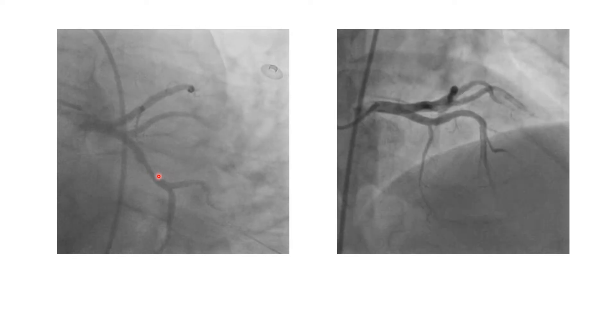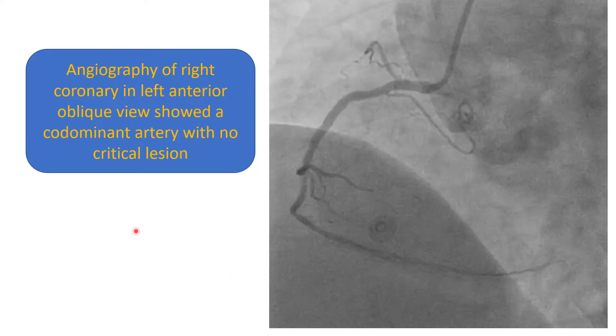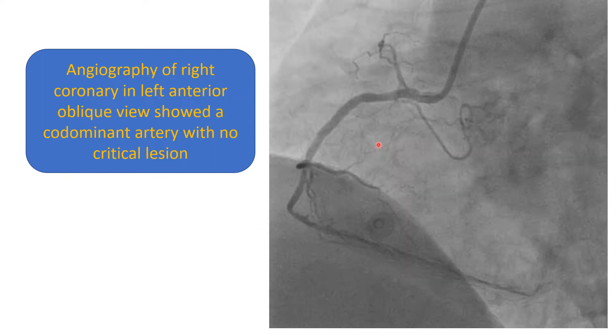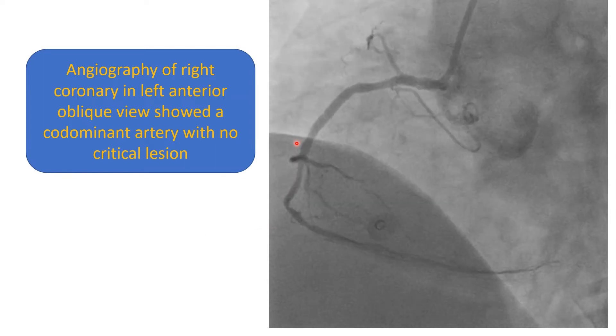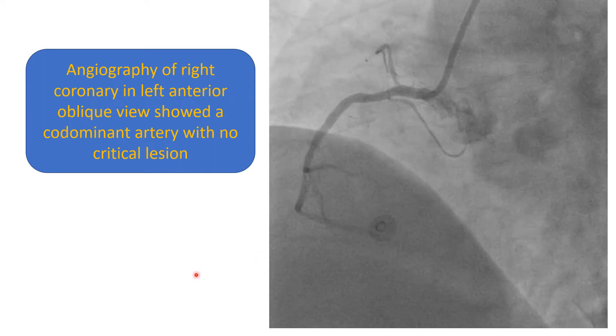A view of the left system shows some intermediate lesion in the circumflex and near-normal left anterior descending artery. Angiography of the right coronary in the LAO view shows a co-dominant or a large non-dominant artery with no critical lesion.